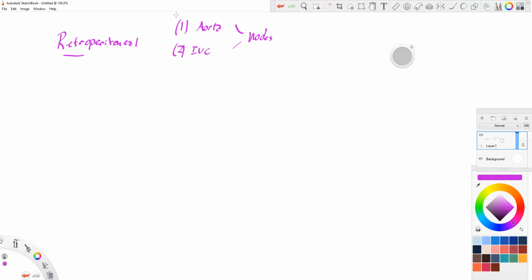Just make sure I am recording. Normally we don't see the adrenal glands, but if you were to see the adrenals, that would be something else to note because they're probably bad. So one aorta, two IVC, three both kidneys, and those are the requirements. And then four, surprisingly enough, the bladder is not technically a requirement. However, you're going to be doing it.